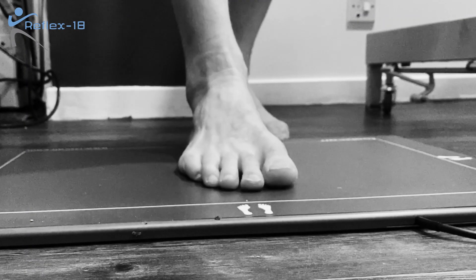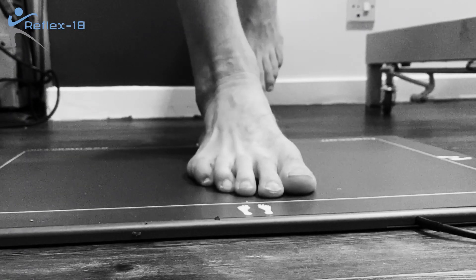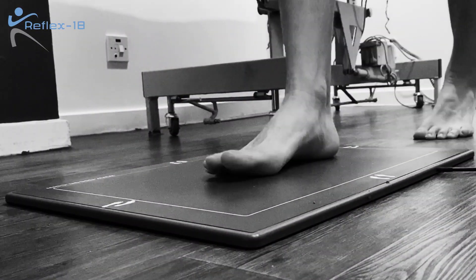Once we've done the video analysis, we'll then get you to stand on the force mats taking static posture data. After this we'll look at your balance on the force mats and then we'll get you to walk or run over the force mats as well.